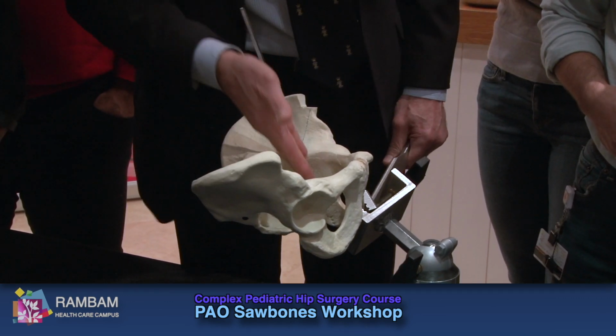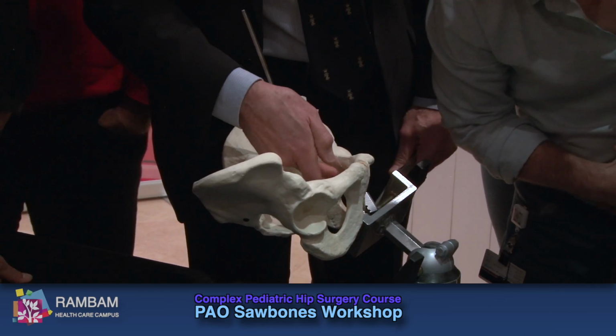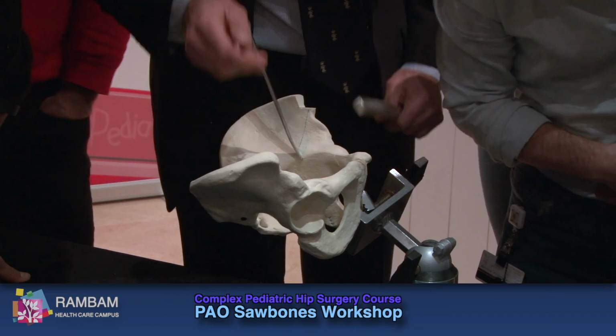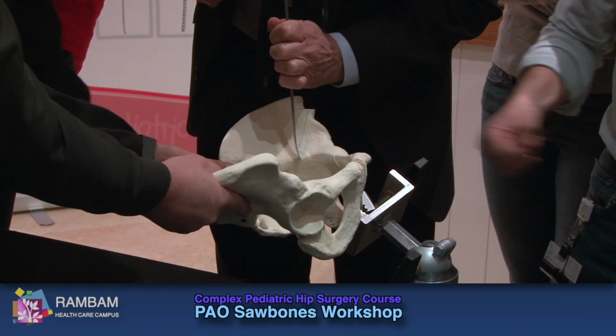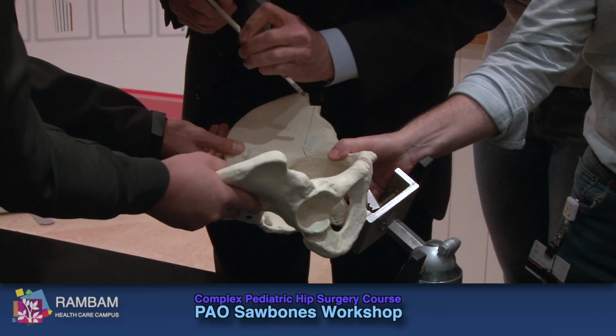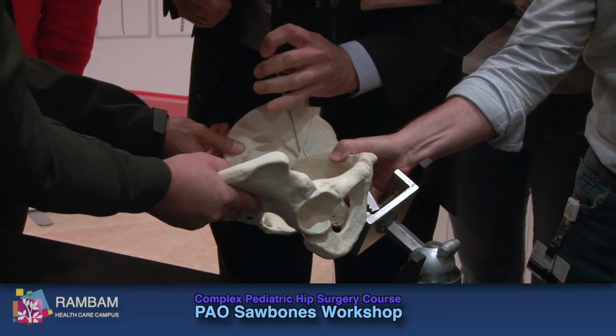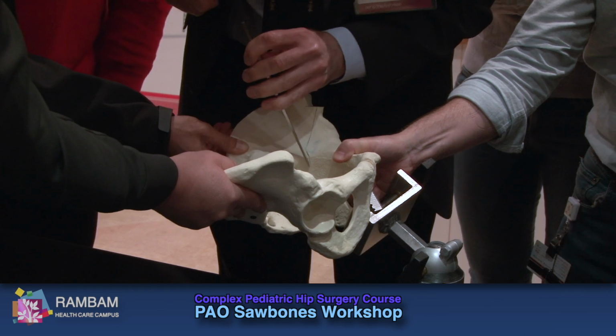What I'm looking at then is that picture. And I can see that I'm halfway between the sciatic notch and the acetabulum. And I want to go down that close to, so a little bit towards it. Rotate a little bit like that. Follow this all the way down.